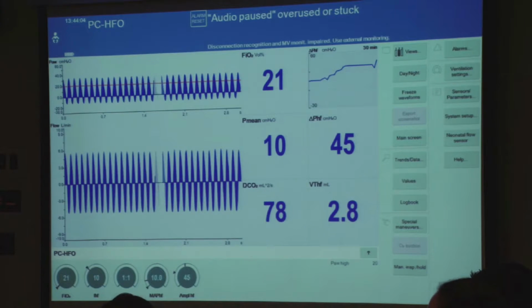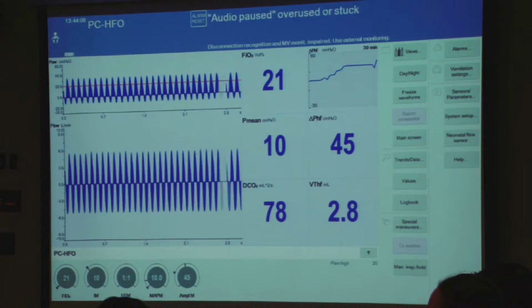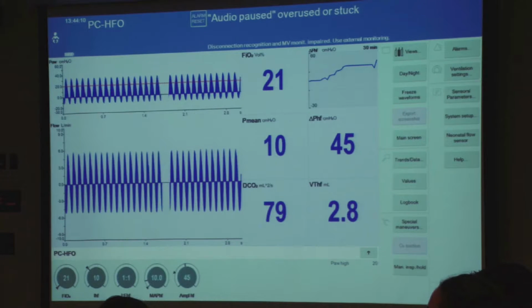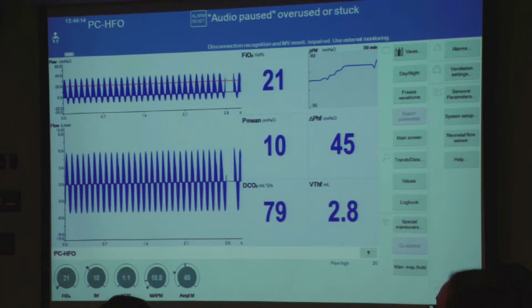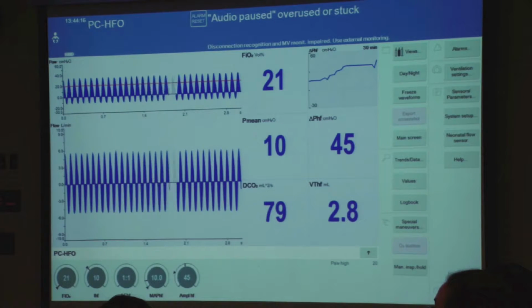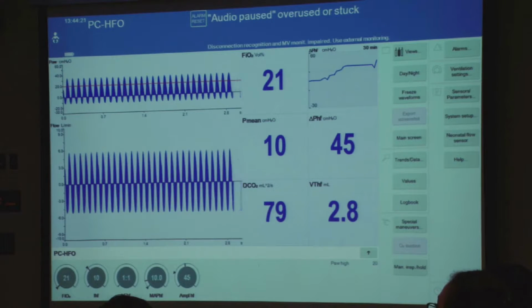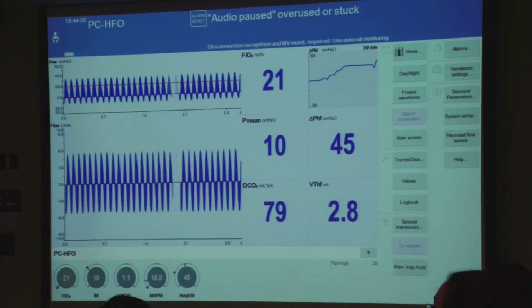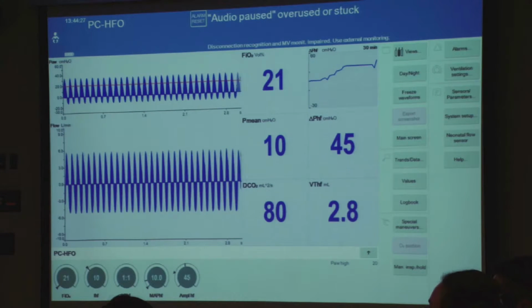But we reserve this. At first lots of people were using this and saying it's the same as the other ventilator, it doesn't ventilate anything above 2 kilos. It does, in fact. We've ventilated 3.5, 4 kilo babies, very full of edema, no problem. But you just have to ventilate differently. Right. That's the whole thing.